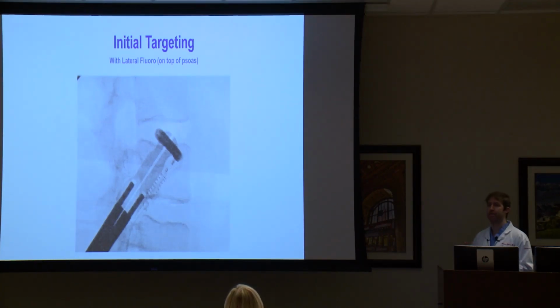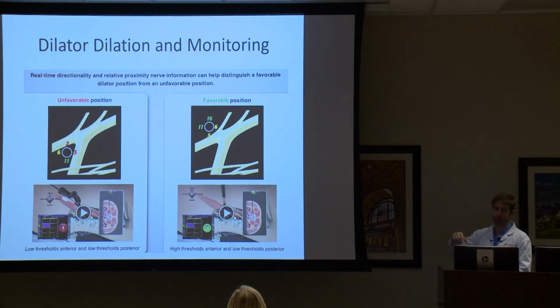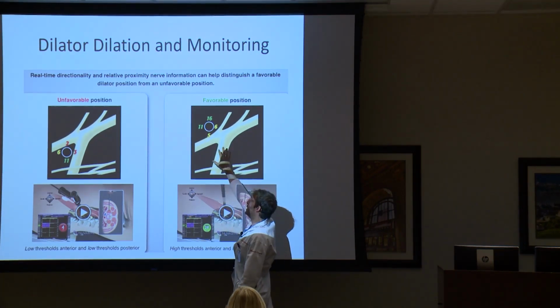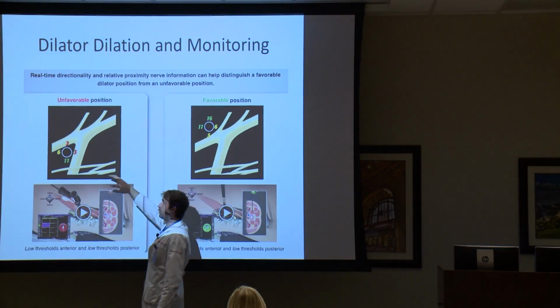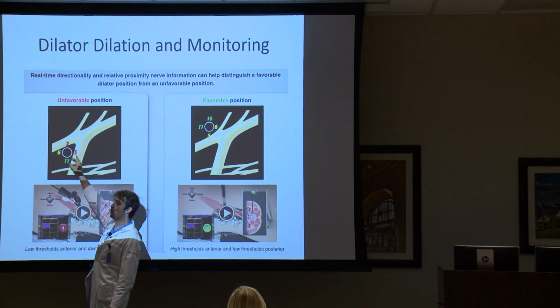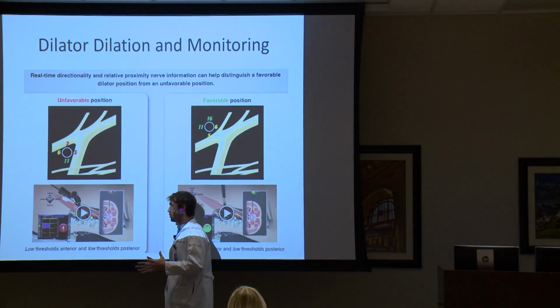And it'll tell you how safe you are, and you can spin that dilator. And depending on where this dilator is, if it's there, then it'll tell you, yeah, all the nerves are kind of behind you and you're fine. If you happen to come down, because remember, you can't see any of this, so if you are coming down here, it's telling you that's bad. You're way too close to a nerve. And if you start to open things up, you're going to cause all sorts of damage.